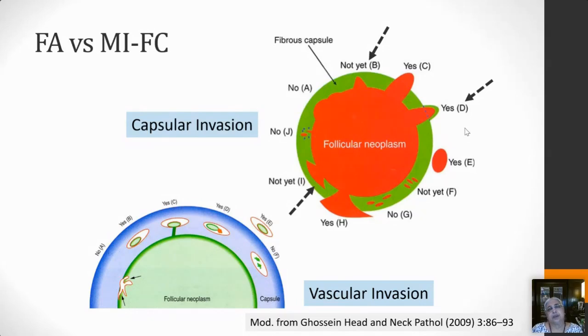It does this because it is the host response to the expansion of the tumor. Now, if you have a tumor expansion through the capsule, and if it is slow, you may get a duplicated capsule beyond. Okay, so here, that's why I think this has been said, yes, because there is another capsule, or portion of the capsule that has formed.